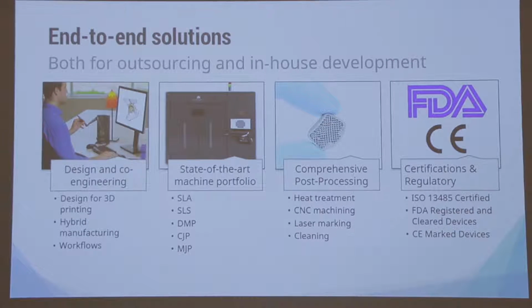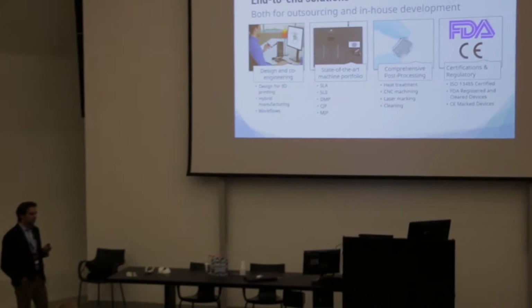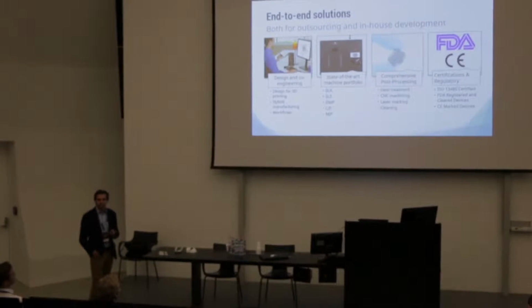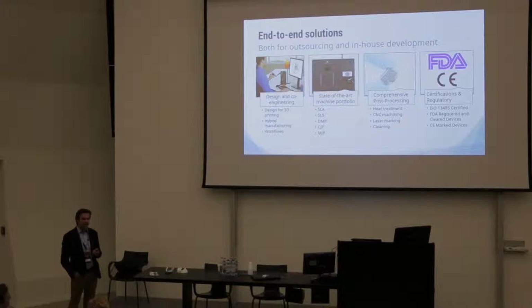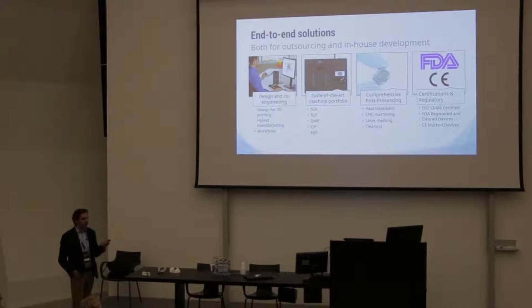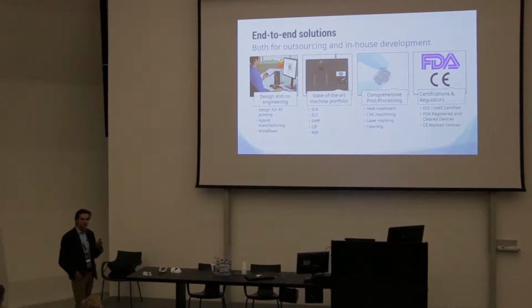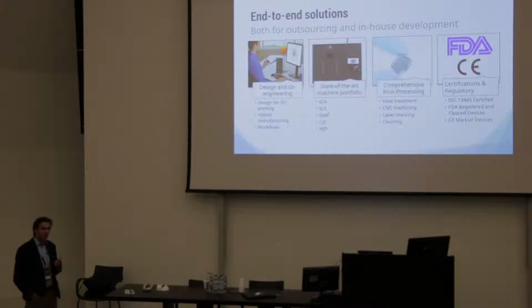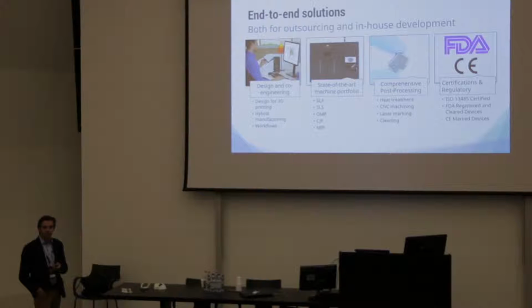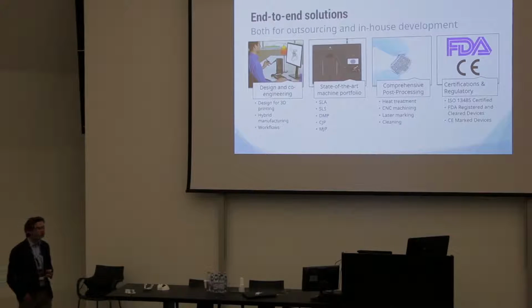We will have our engineering group work together with the engineering team of the medical device company to really look into the design of the implant and how we can optimize that design for 3D printing. While the medical device company or surgeon will take responsibility for functionality, so the performance of the implant, we will cover how well this design is tailored to 3D printing. We will try to get these people to step away from thinking about conventional CNC subtractive manufacturing and think about how to optimize for 3D printing to achieve the best results, to get a functional part coming off the machine while still maintaining the intended functionality.